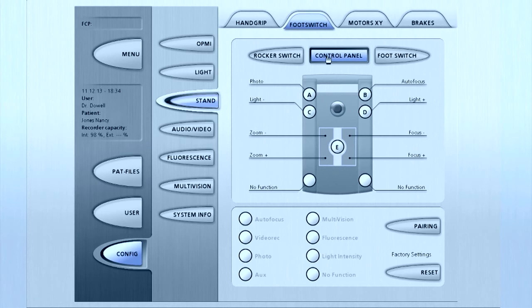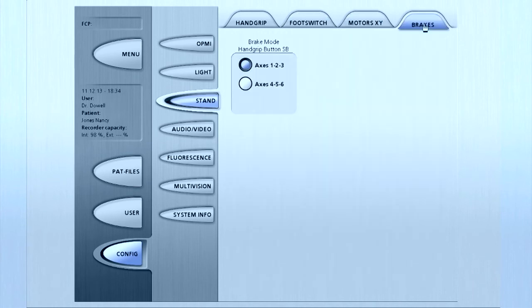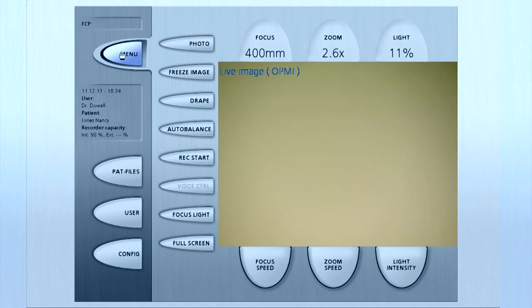In this case, we are programming the B button and changing it from autofocus to fluorescence. Continue to touch the top tabs and program functions according to user preferences. When finished, press Menu to exit.